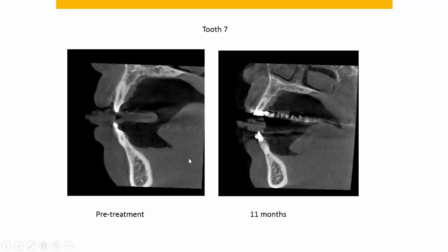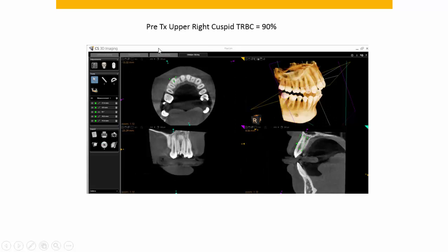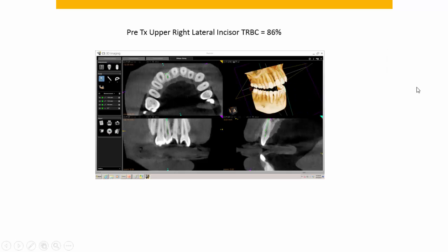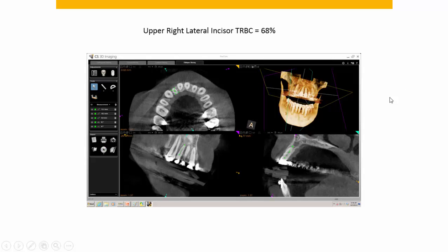The upper right lateral incisor was tipped out labially to correct the anterior crossbite — what you'd expect to happen, happened. Pre-treatment, the upper right cuspid had 90% total root bone coverage, and after retracting it to class one it's at about 79% — which really isn't bad. You never end up with more bone than you started with when you reposition teeth. The upper right lateral incisor started with 86% total root bone coverage, and at the time of this cone beam CT it's at 68%, with a little more movement still to go.